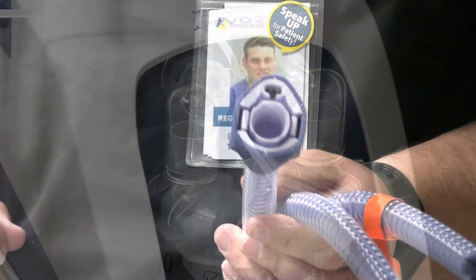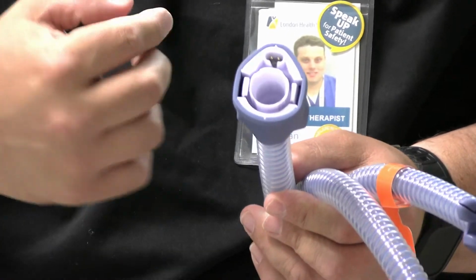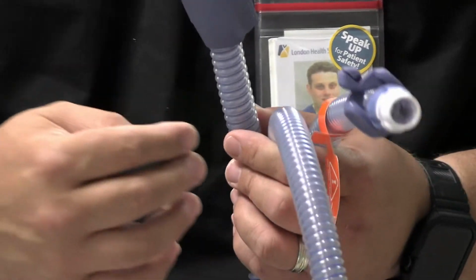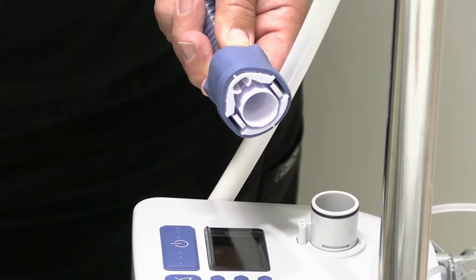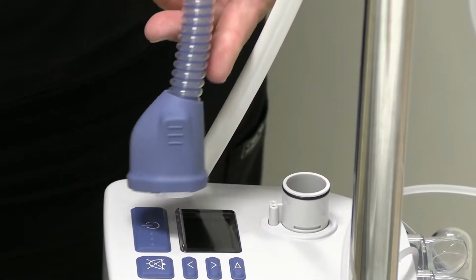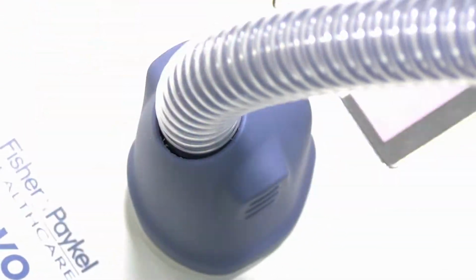When you are going to attach the patient circuit to the device, there is a built-in heated wire that has to be powered by the device in order to keep heat throughout the entire circuit. So you're going to take your patient circuit and you're just going to line it up with the male and female connections on the device. Just push it down and you'll hear it lock.